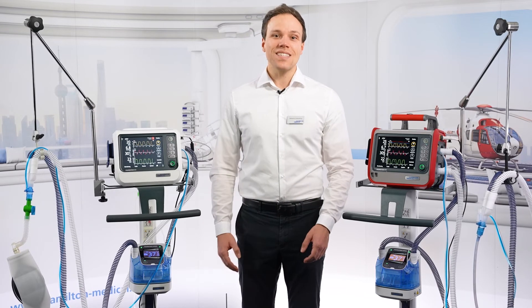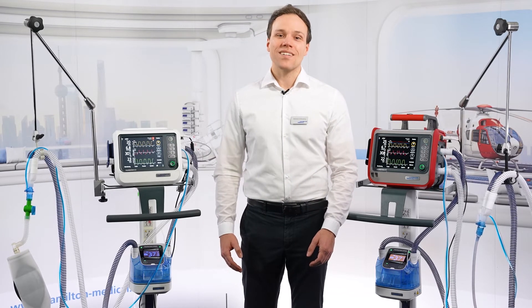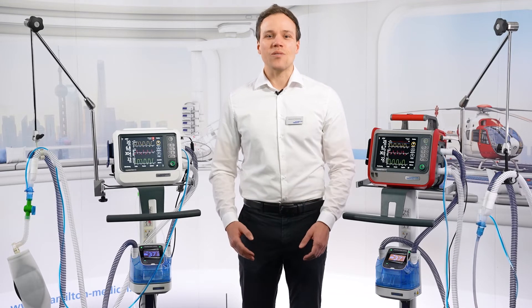We know it can be easy to forget switching off the humidifier, but now you don't need to worry about this anymore.